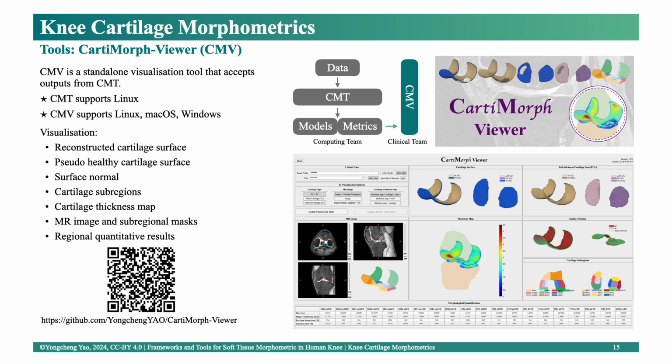We also built a standalone version of the visualization module called CartiMorph Viewer. It may help with data sharing across collaborators. With the viewer, users can check the intermediate results and the final metrics. The viewer is also available on GitHub.